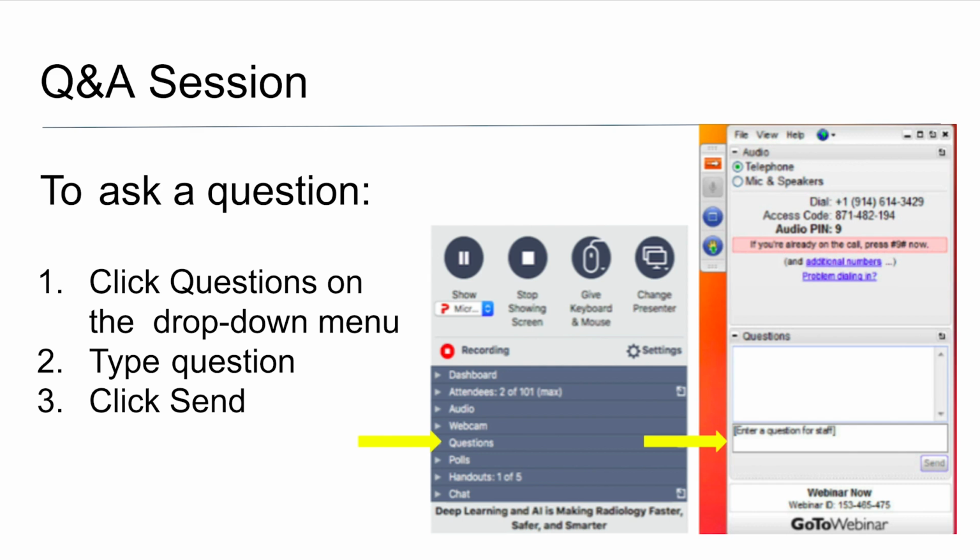And also for amyloid PET, there are positive and negative readings, which is directly related to Alzheimer's disease diagnosis and detection. And we show basically with this algorithm, you can get consistent accuracy if you ask the radiologist to review the image. And also for different applications, we also quantify the quantitative SUV value for different lesion types.